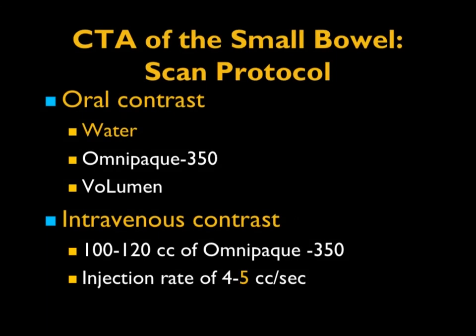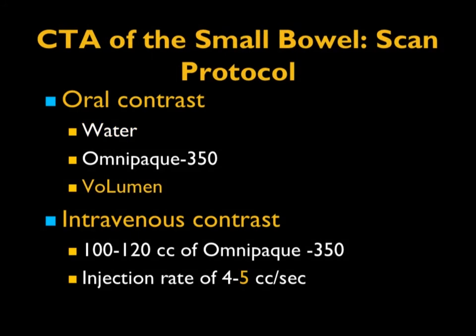Okay, so in general, you're doing GI tract. Protocol, of course, is critical. We're using water as a contrast agent and using IV, typically trying to inject it 5 cc's a second. We're either using Omni 350 or Visipaque 320. The injection rate becomes very critical. Good IV access, 18 to 20 gauge. If you have the new BD catheters, you can go with a 20 gauge.